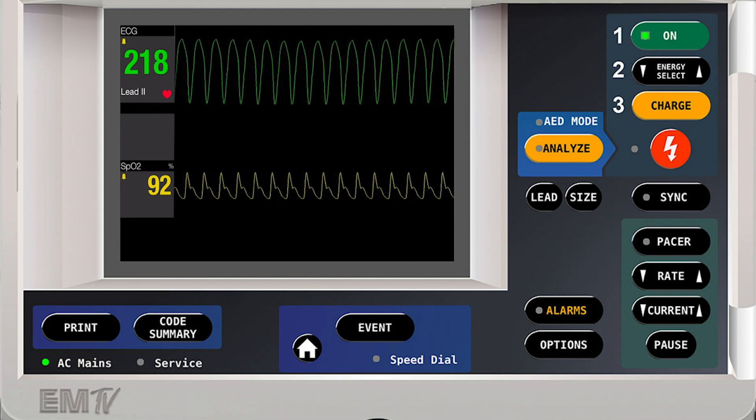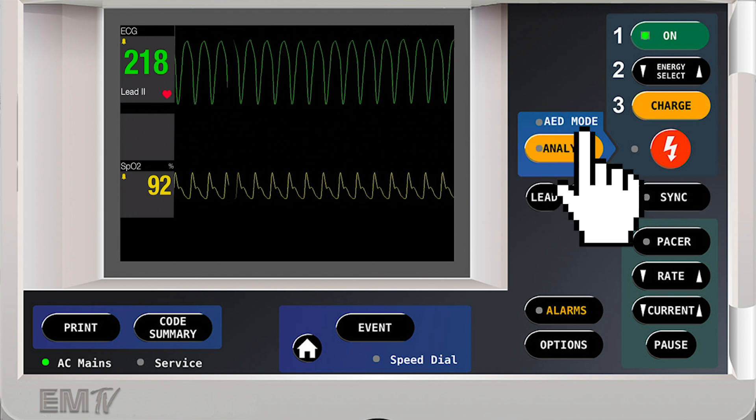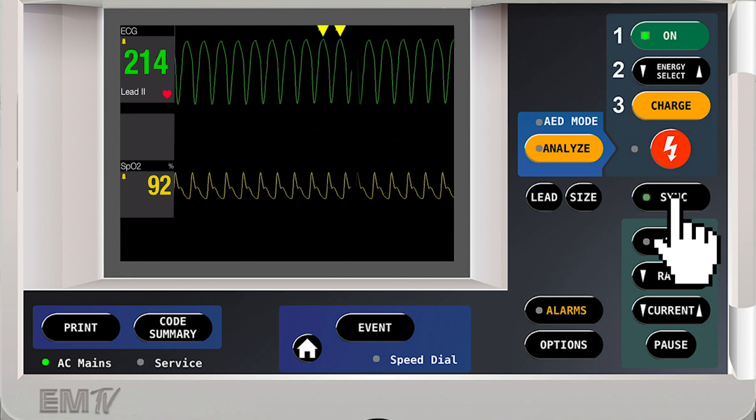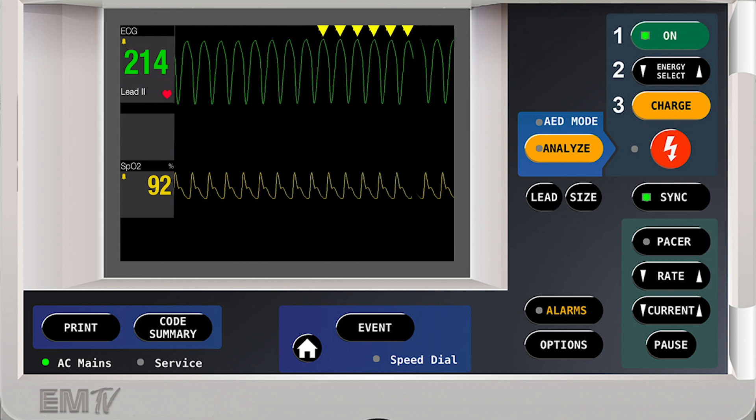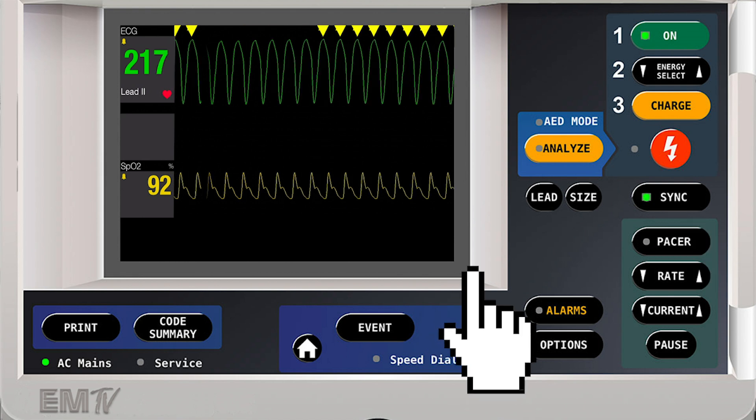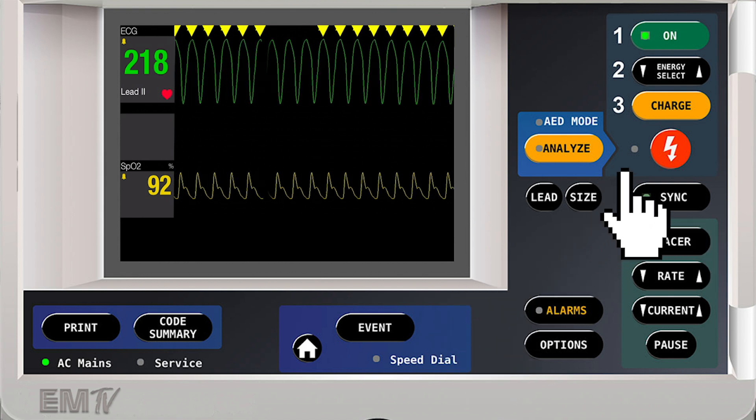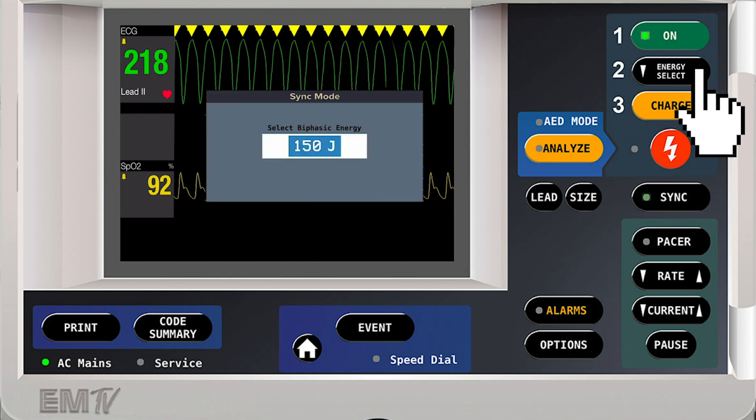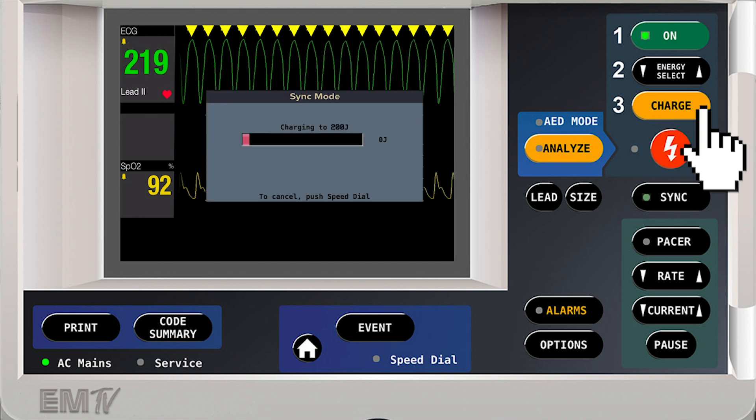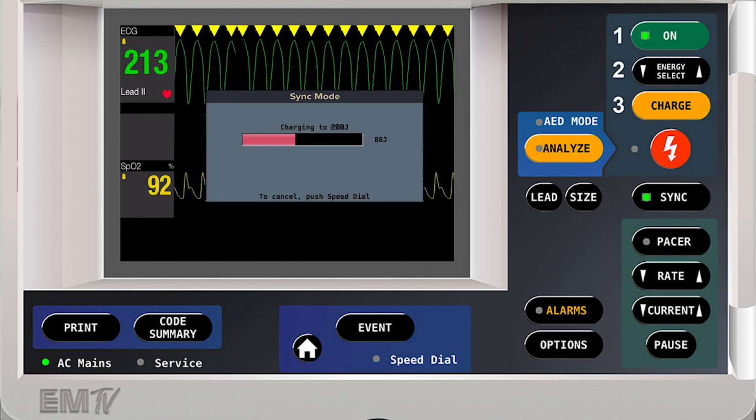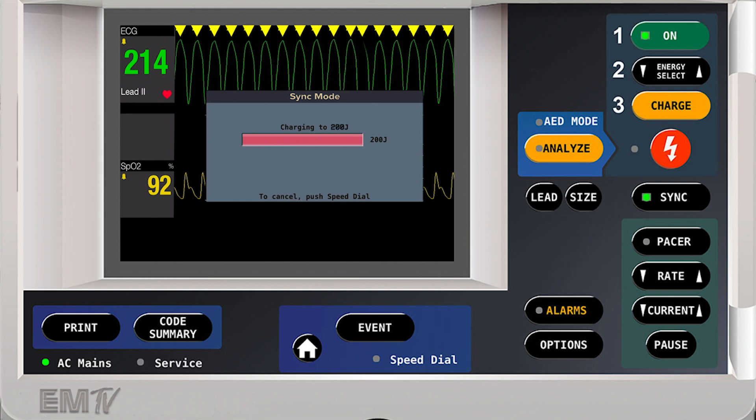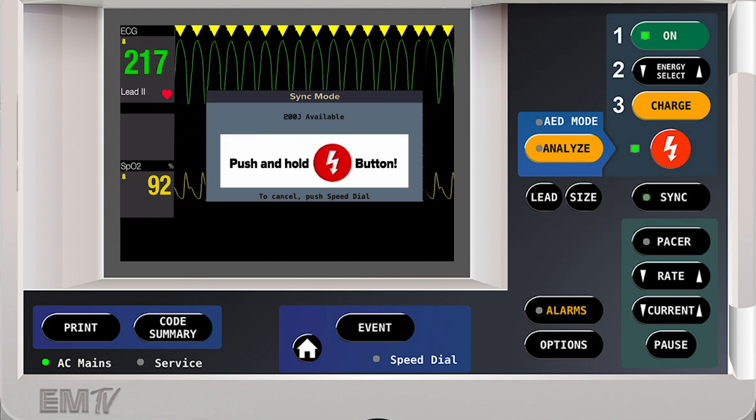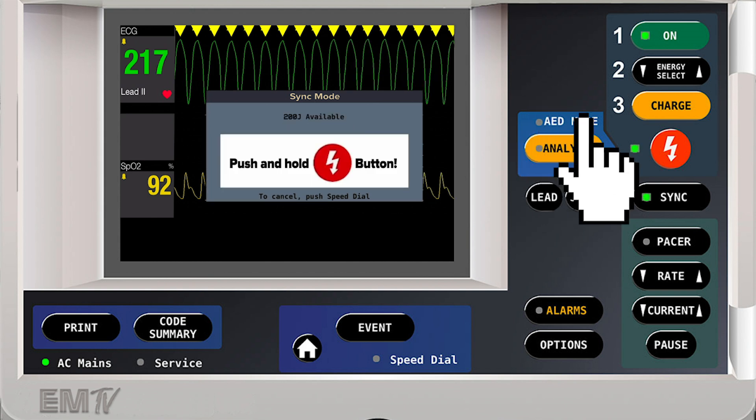For the next shock, I'll repeat the process. Press the sync button, making sure I can see indicators above all R-waves. Increase my energy in a stepwise fashion. Then charge, and when ready, clear my patient and press and hold the shock button.